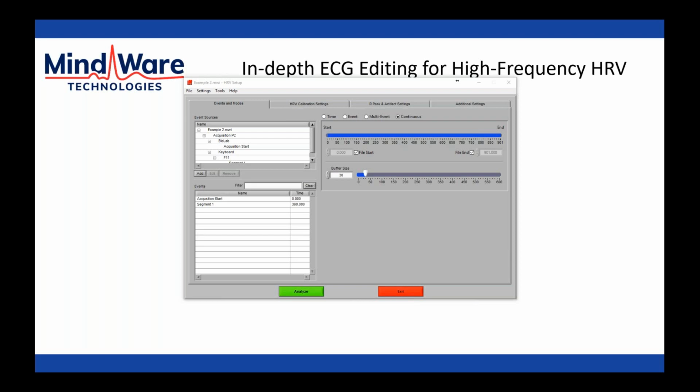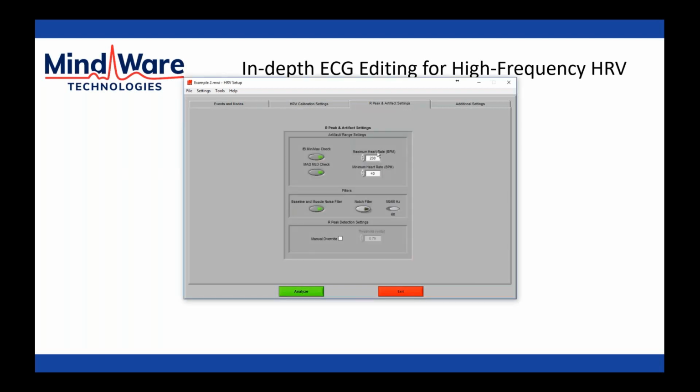In that situation, though, another thing that I would recommend checking is that your average heart rate is not coming anywhere near this maximum or minimum threshold for your IBI min-max check. Because sometimes beats can be flagged simply because they exceeded these thresholds and we forgot that we had them in place. And so in that situation, if it just exceeded that threshold, it's probably fine to leave it, and you probably just have to adjust your IBI min-max threshold to allow for beats like that to occur.